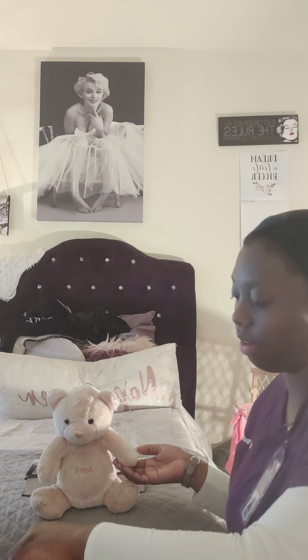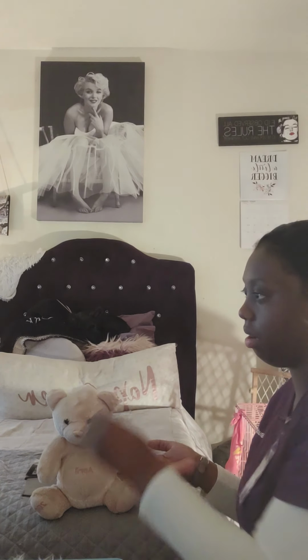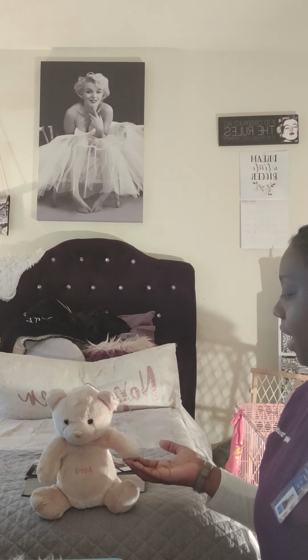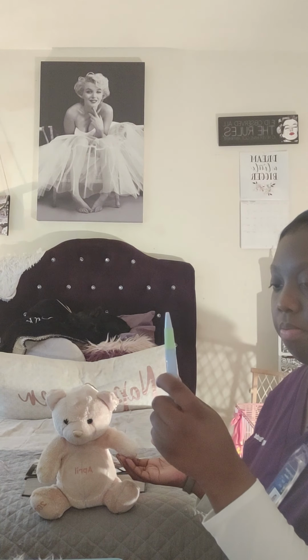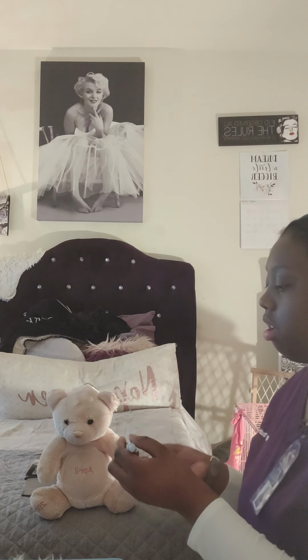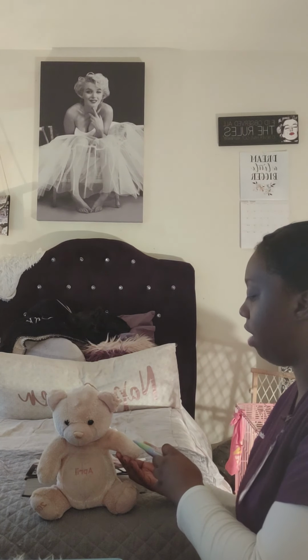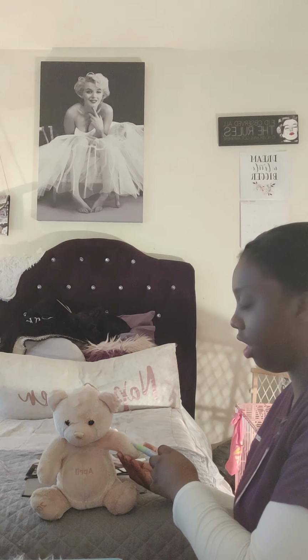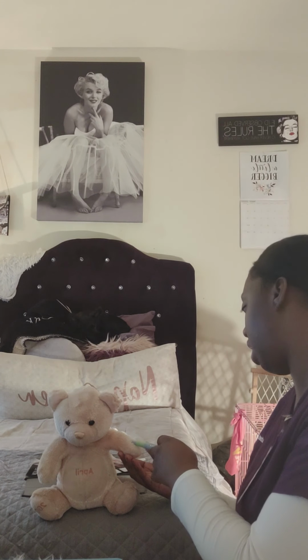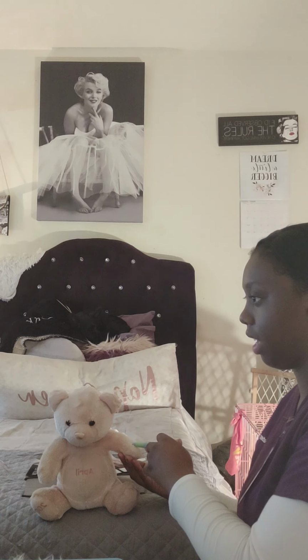So after I inspected the area, I'm going to take my gauze and cleanse the area, going inward to outward, allowing the area to dry. And then once the area is dry, I'm going to take my syringe with the needle on, uncap the needle, put it down, and then with the bevel up, I'm going to take the needle onto the skin, insert it about 1/8 of an inch in between a 5 to 15 degree angle, and slowly inject the medication.